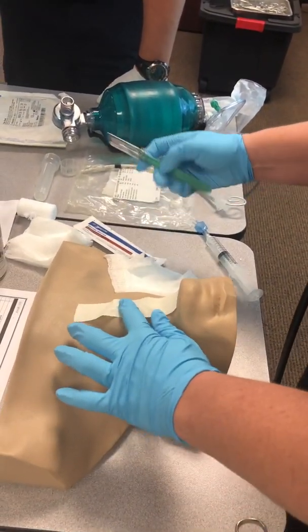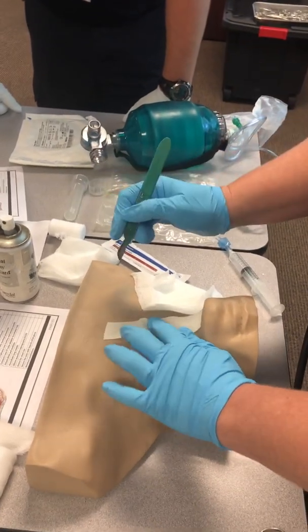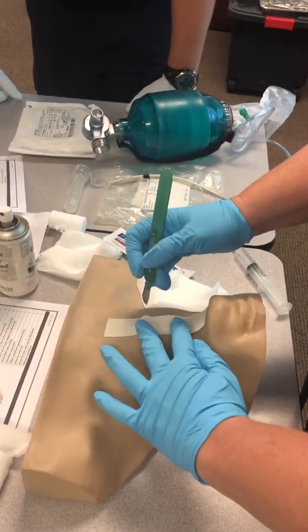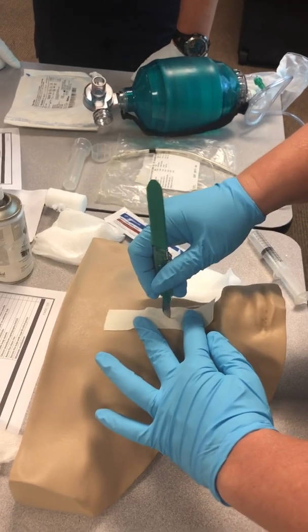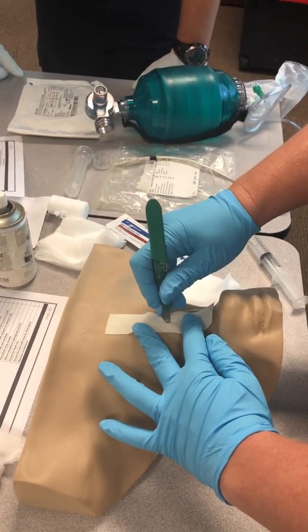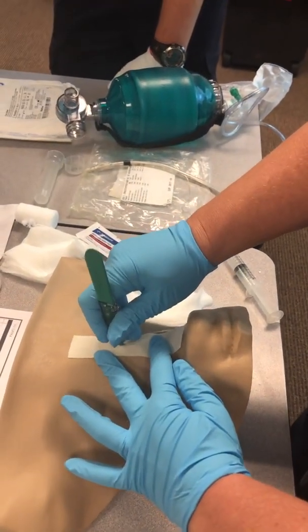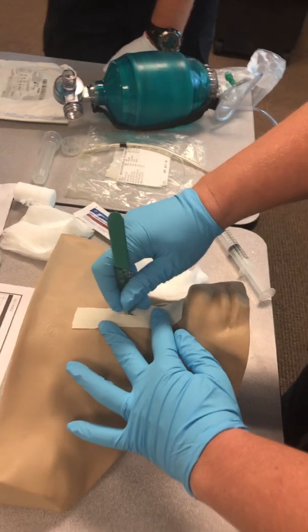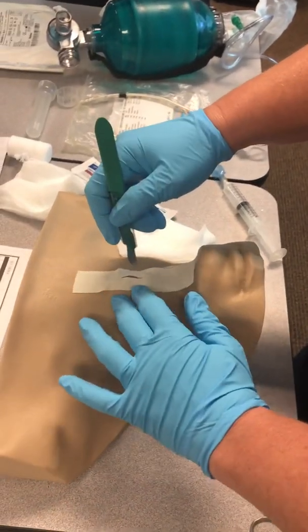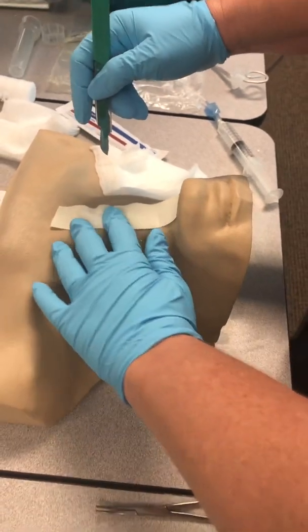Take the scalpel, make sure it's away from you, and make a vertical line — cutting away. She's cutting from the thyroid cartilage to the cricoid cartilage through the cricothyroid membrane. That's a one to two centimeter cut.